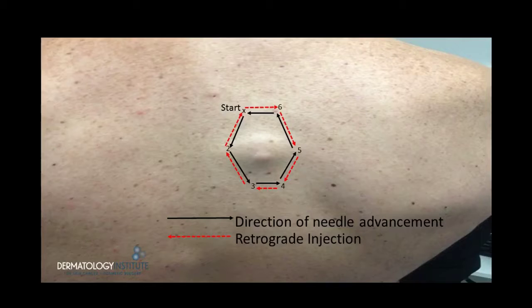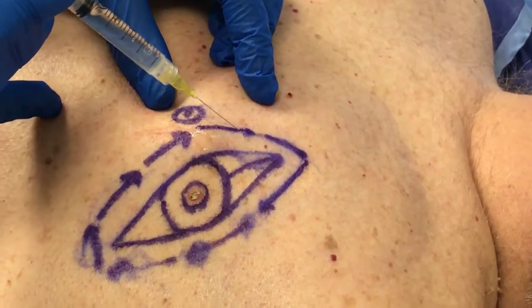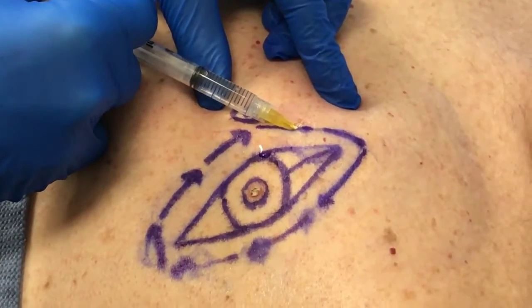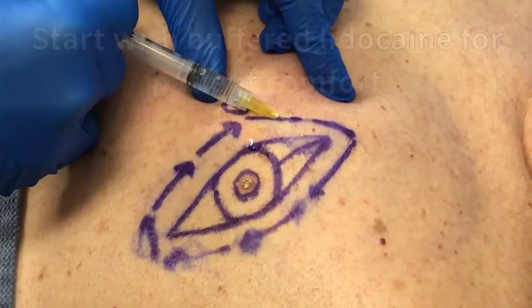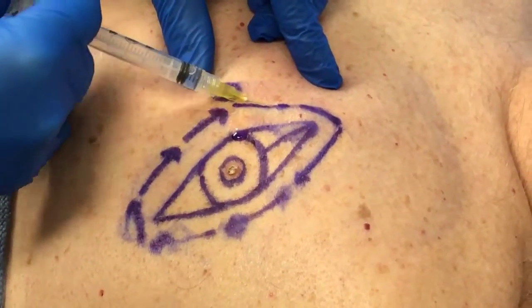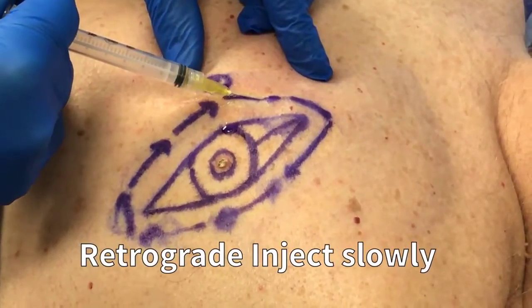Here we see how to perform a ring block on the back for a cyst. When commencing with the procedure, the skin is stretched and the needle slowly advanced. A retrograde linear administration is performed, creating a nice and even line of anesthetic.